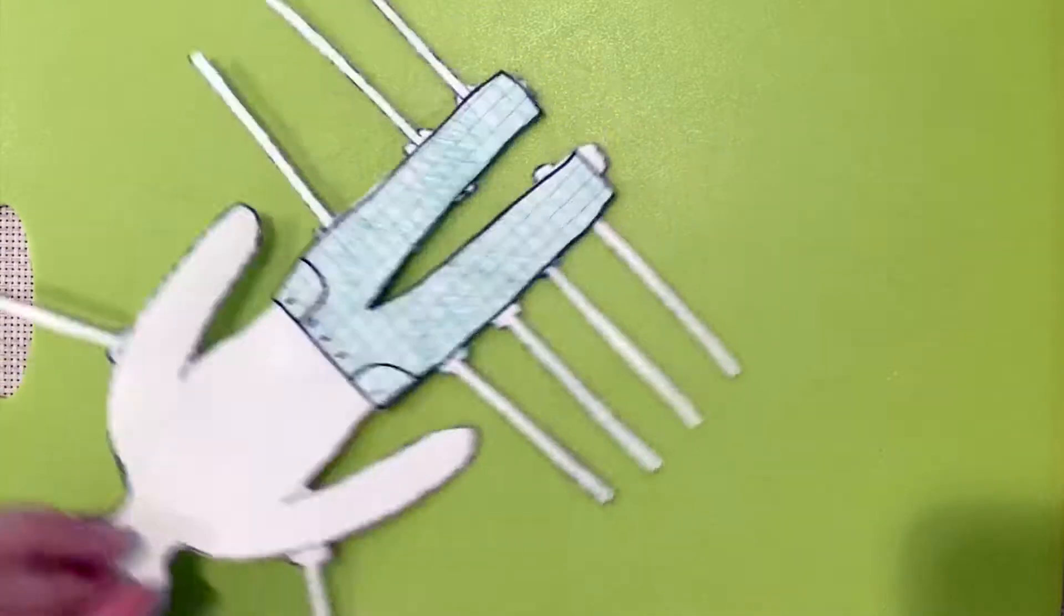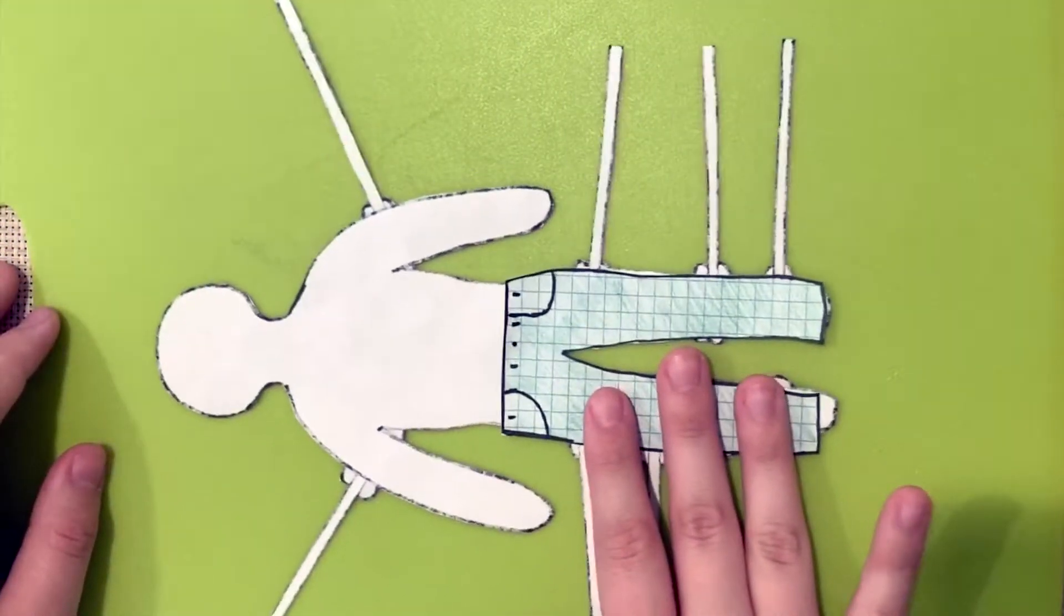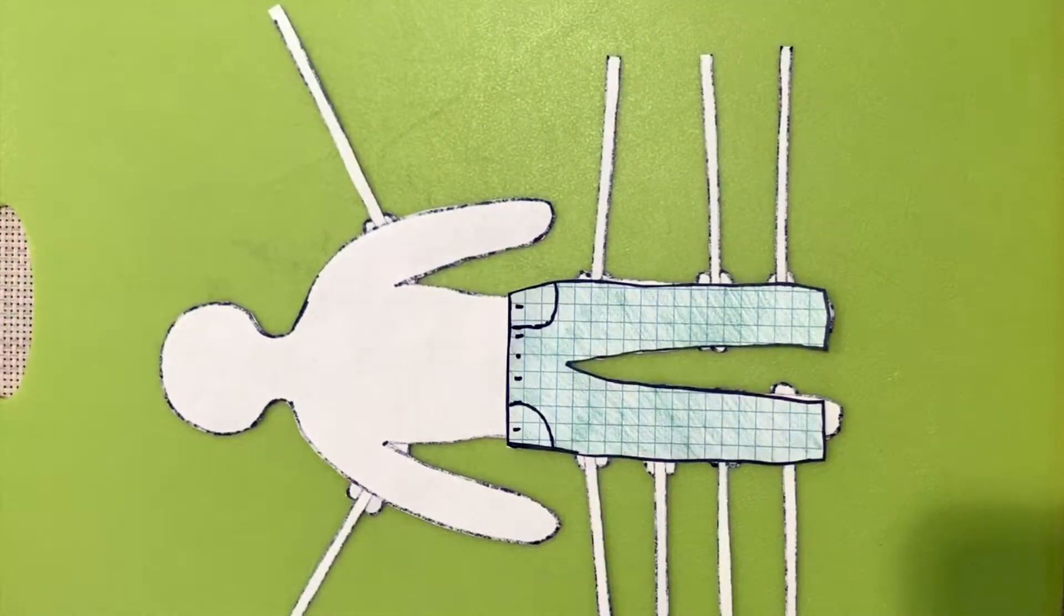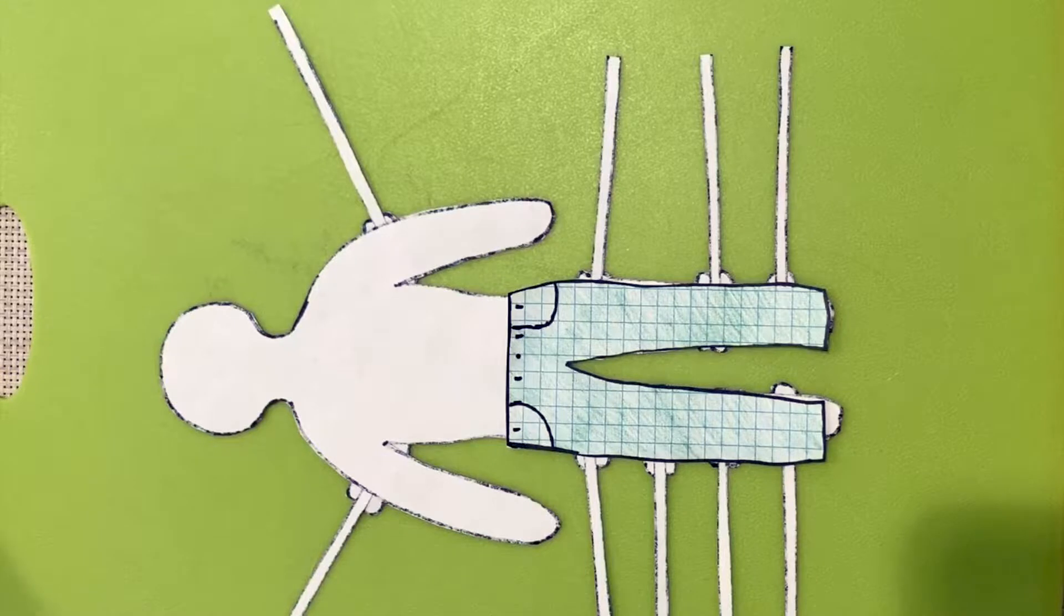This is Gary. He will be our patient for today. Gary has been experiencing some pain in his lower extremities and his doctor has ordered a lower extremity segmental pressures exam with PVR.